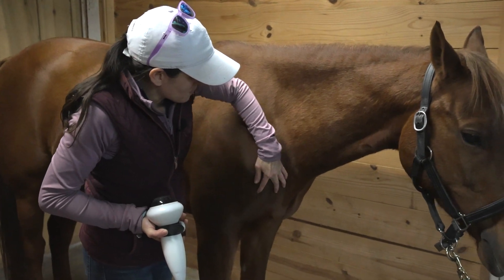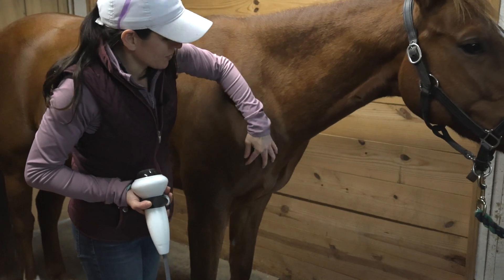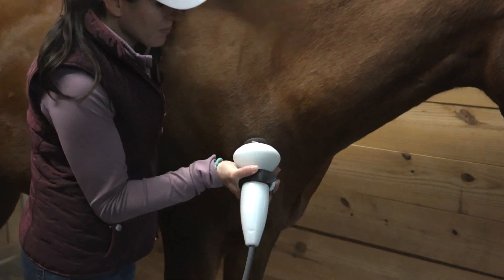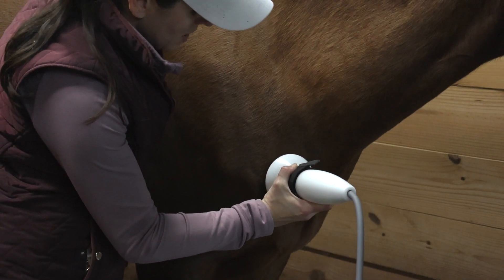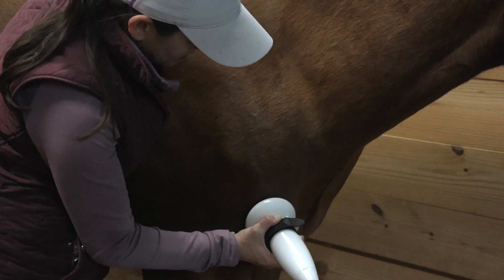Your shoulder joint is a bit more 3D and has a little bit more surface area. When using the probe, you want a nice flat surface, and you're just going to slowly run your probe down the shoulder, around the joint.